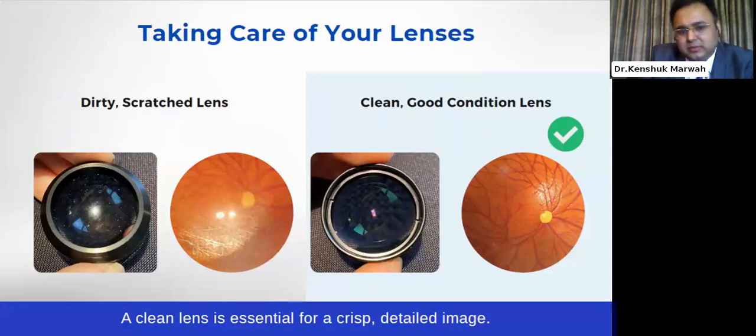Now, see, this is a dirty lens, and the amount of glare that we are seeing on the left side, and with a good clean lens on the right side, the image of the retina is also much better. If you keep your lenses properly, rather than buying a different platform of lenses, it's a compounded benefit. It's like compound interest. You add one lens and then you add another lens, so you keep slowly adding lenses in your clinical practice. If you keep the lenses which you already have properly, it will be good for the clinician themselves also.